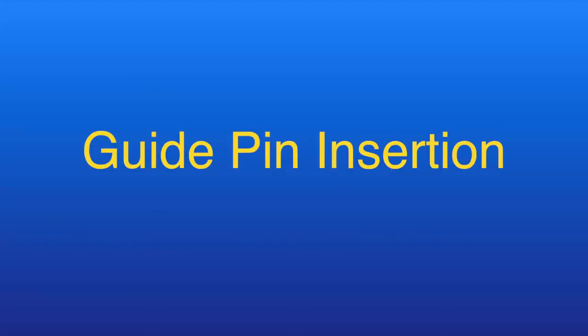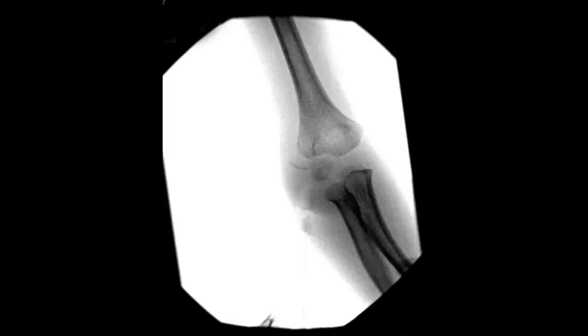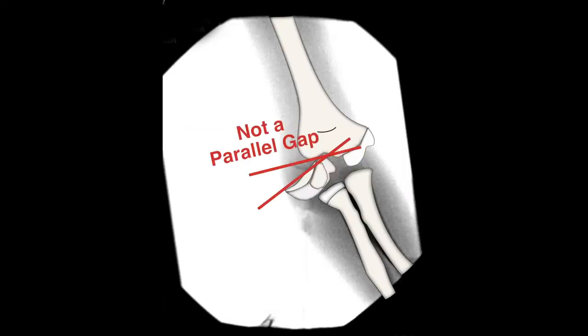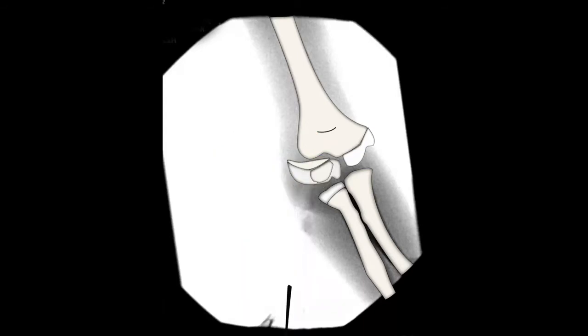and reduction. Once the reduction is complete, or only a parallel gap remains, a guide pin is inserted.